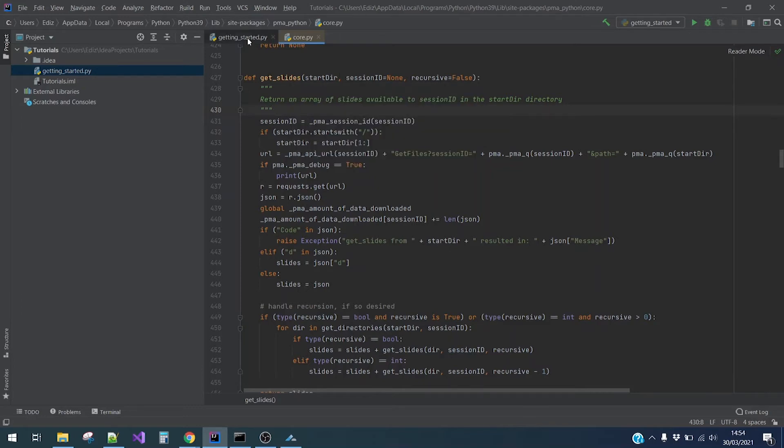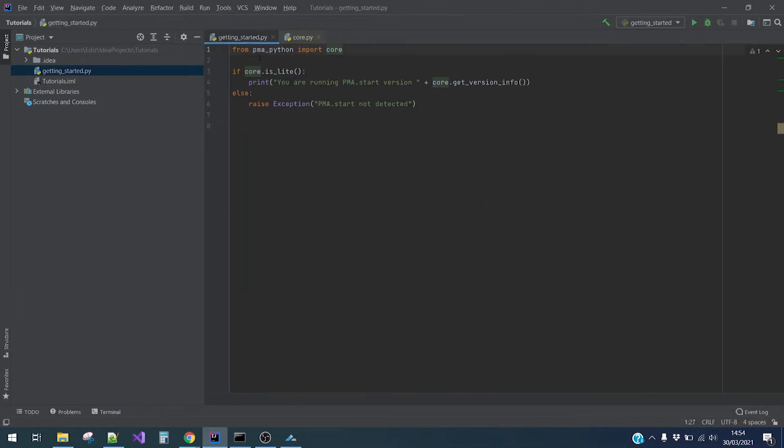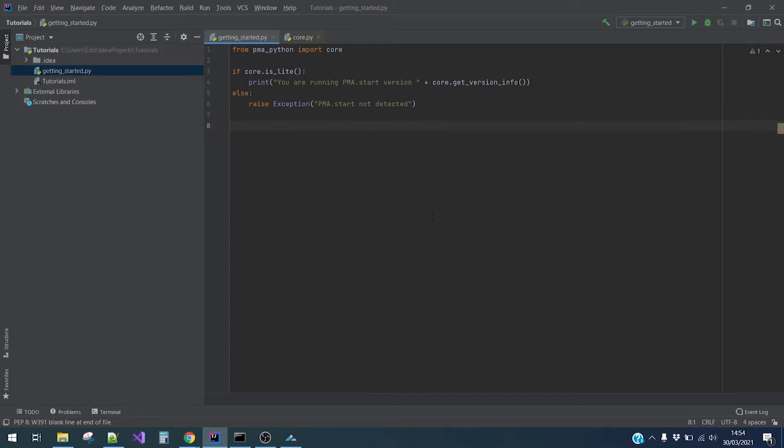I will write a for loop to go over the slides that are in the current directory. So I will write for slide in core.getSlides.